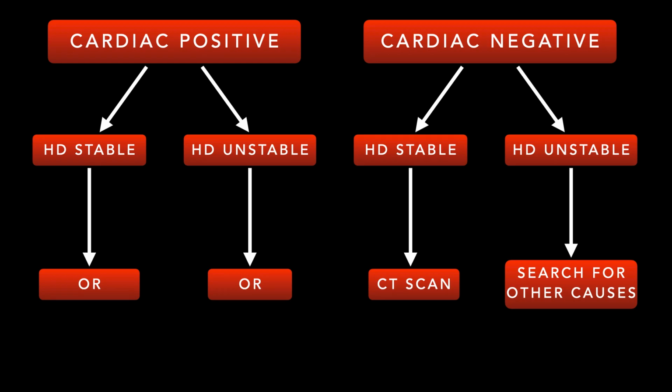And so there needs to be definitely a thought towards this patient going to an operating area to get this drained and further assessed, right? Now, there may be some little asides if they're hemodynamically stable, but it needs to be a patient of high concern. Now, you could say, well, what if they had an effusion previously, and they come in having a minor car wreck and now they have an effusion again? Yeah, we can nuance that a little bit. I think that's a good discussion. We've talked a little bit about that on this forum with our trauma folks.